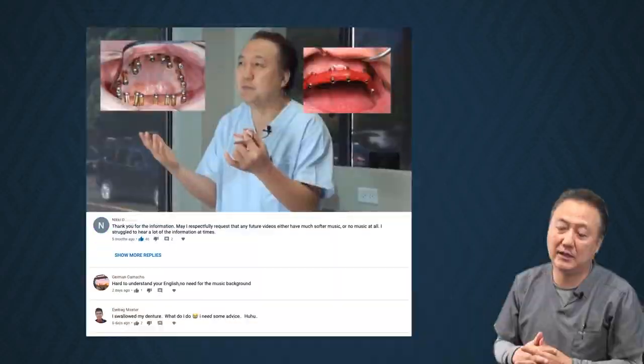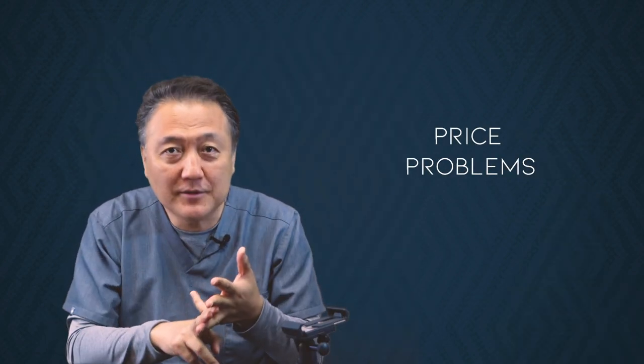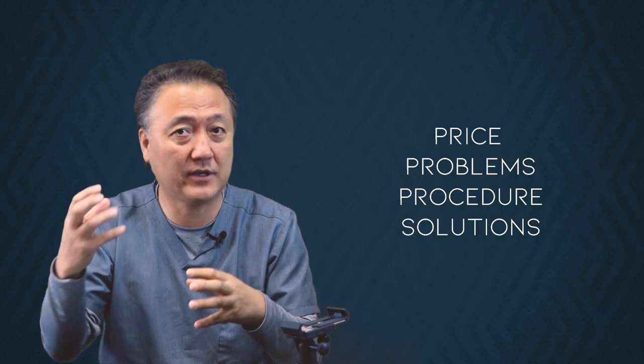January 2nd, 2020. Happy New Year to you. I do have a lot of response regarding full mouth implantology, and you guys had a lot of questions about the price, the problem, the procedure, and the solution. So this video, we're going to share all those kinds of information with different cases.